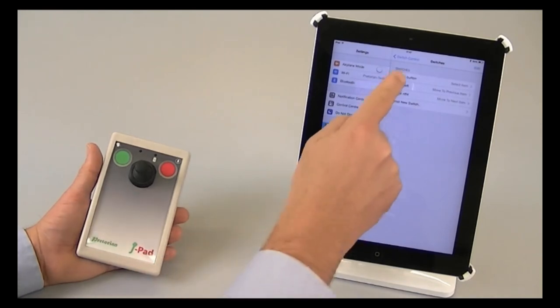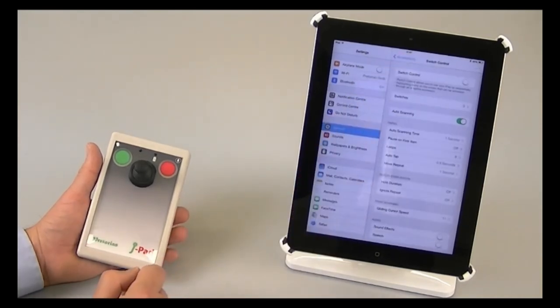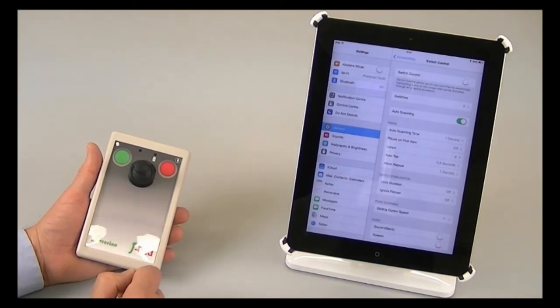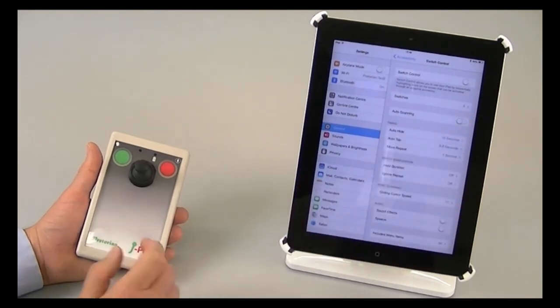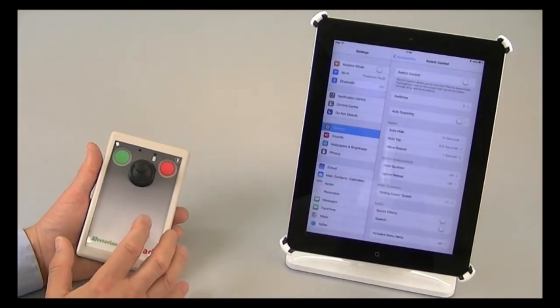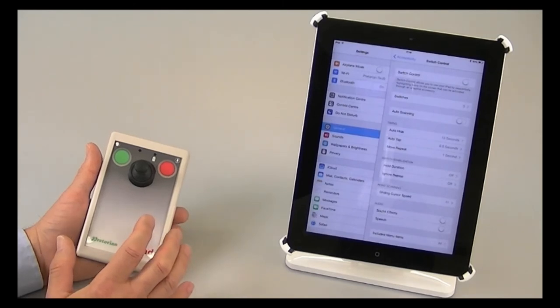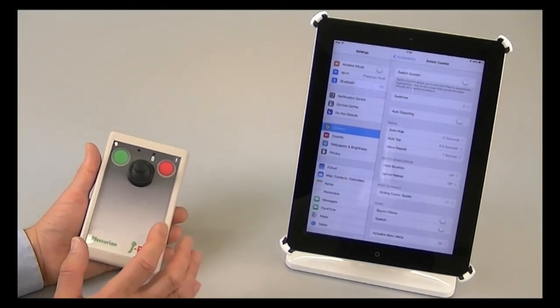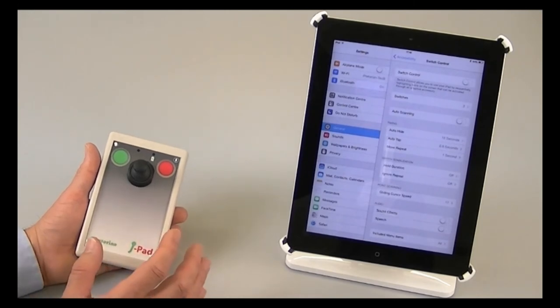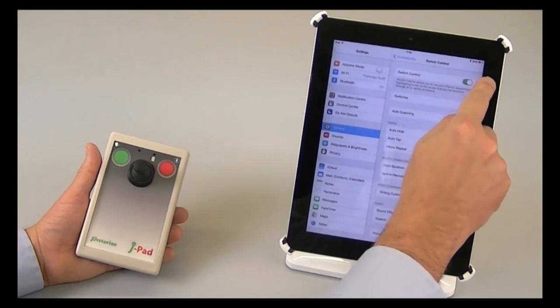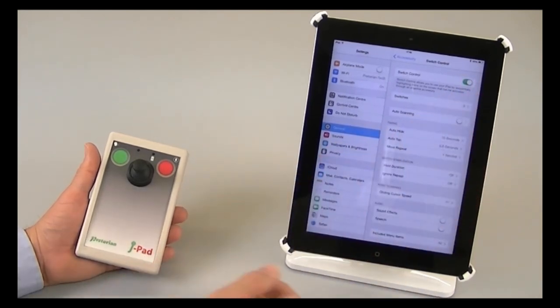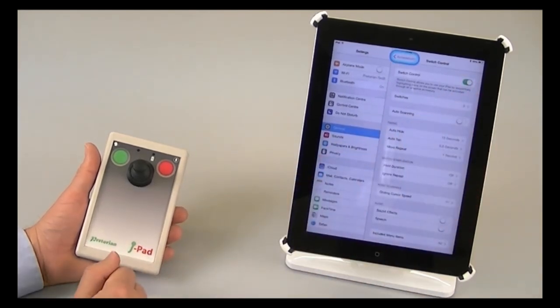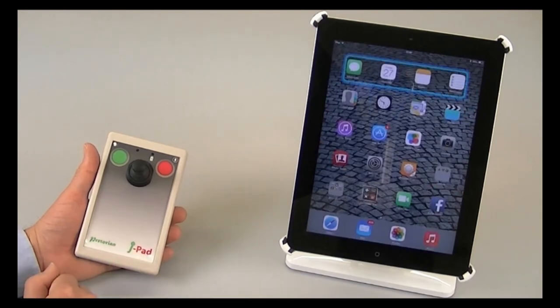If I now return to the switch control main menu, then I'm in a position to be able to turn on switch control. First of all, I'm going to turn auto scanning off because J pad is a manual scanning device, and auto scanning can't be on at the same time. And in fact, if I did leave it on, it would simply turn itself off anyway. All that remains is just to turn on switch control now using the slider at the top. And now I'm in switch control mode, and the J pad is ready to use.